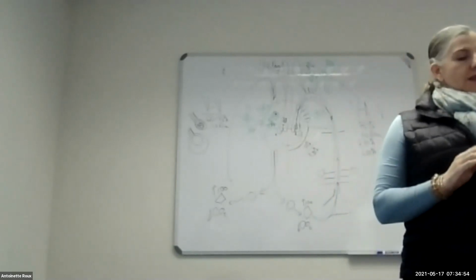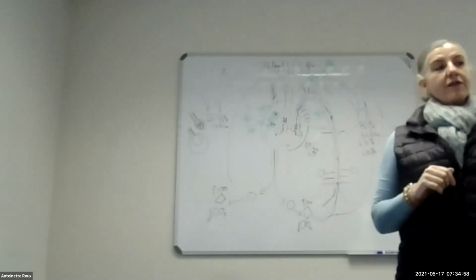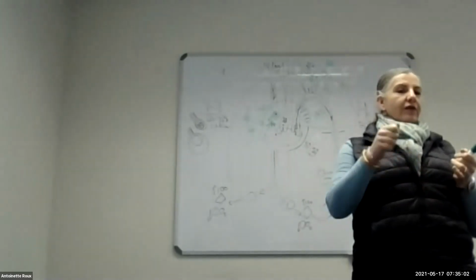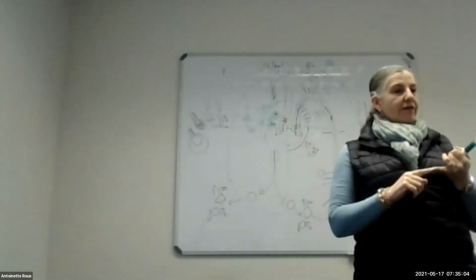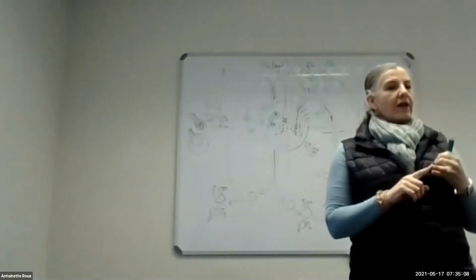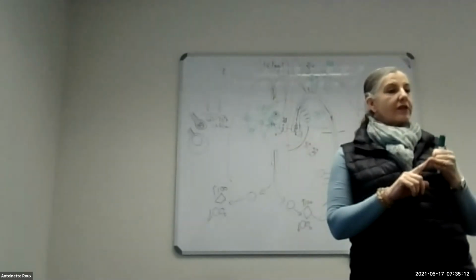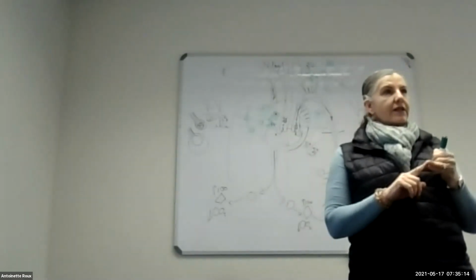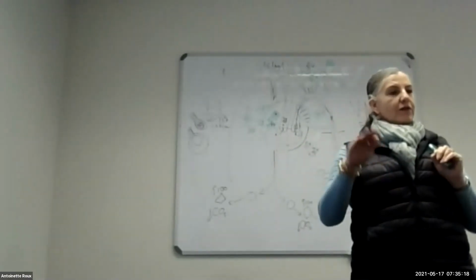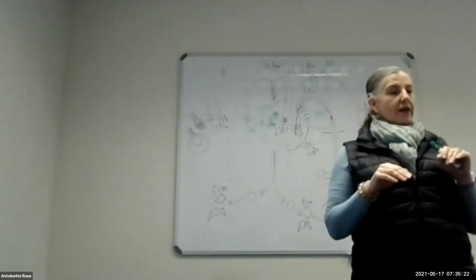So the 4 things that can actually interfere with your SVO2 or lower them is, first of all, you're not giving enough oxygen. Your PO2s are low, and you're upping your FiO2 and it doesn't work. The other one is work of breathing, work of anything where your patient uses energy. So when you've got an awake patient on ECMO, you will see that the SVO2s will also fluctuate according to the energy usage that's happening there.